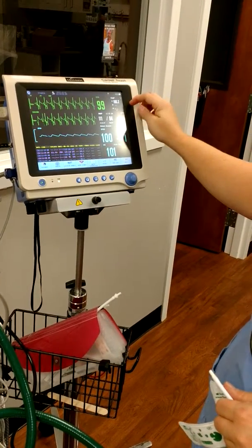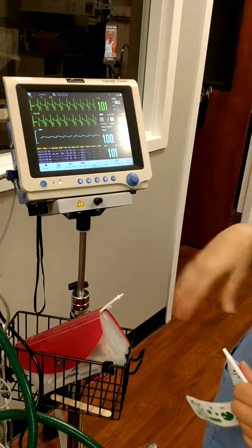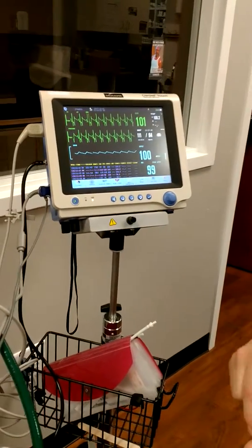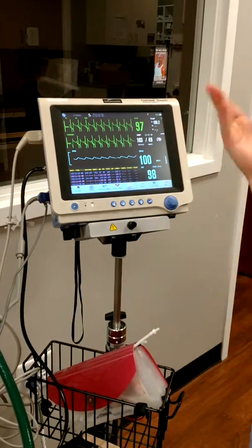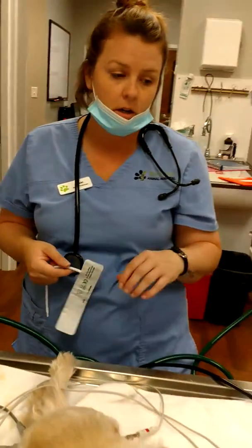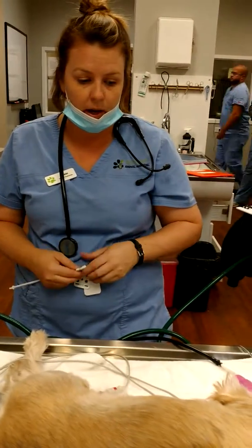Her temp has equalized, which is a great temp for her. She is a small dog, and we have a towel to put over her during the anesthesia. We're getting great blood pressure results. I'm going to leave the smaller cuff on her — I think that's a better fit — and we'll go ahead with the procedure.